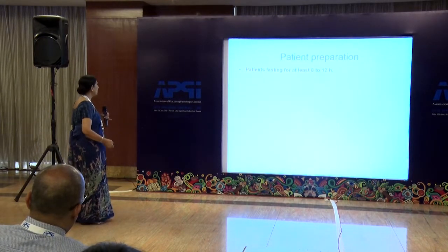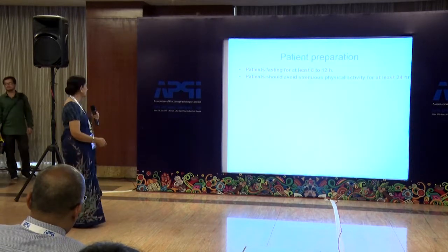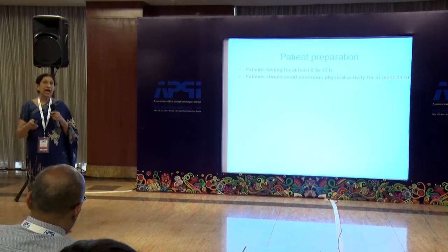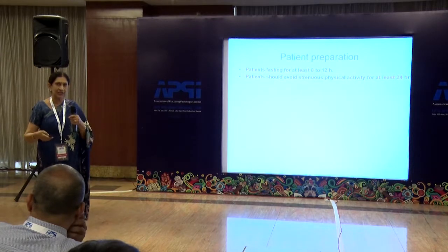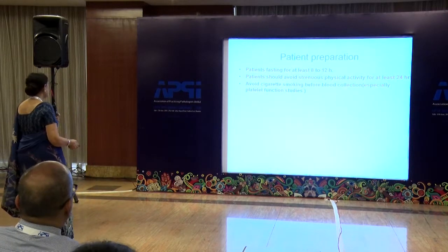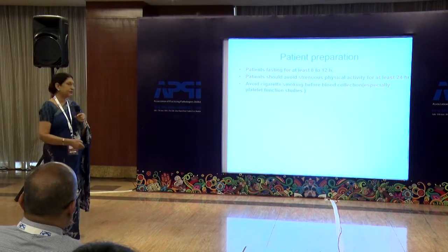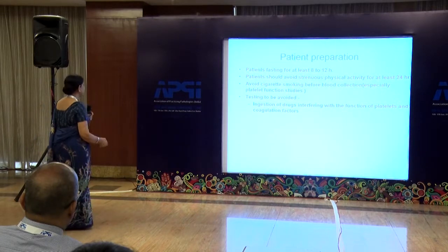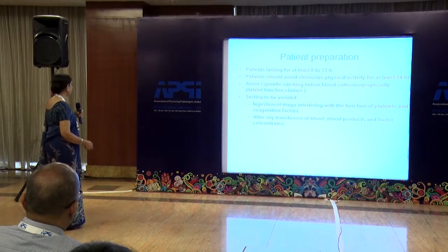Now, patient preparation: the patient should be asked to fast overnight and should avoid strenuous physical activity. Very important, because that activates certain factors in the body. Avoid cigarette smoking, especially for platelet function defects. Testing should be avoided if there is ingestion of drugs interfering with the platelets and other coagulation factors.